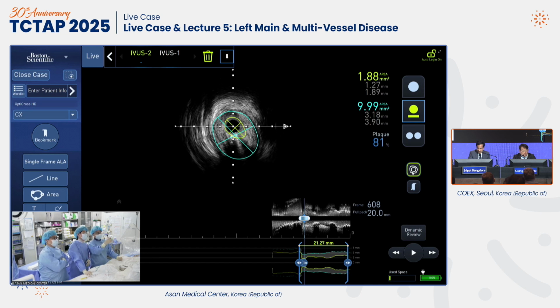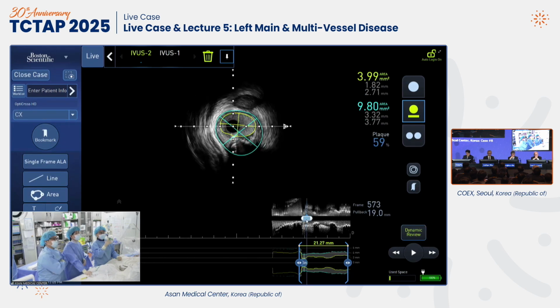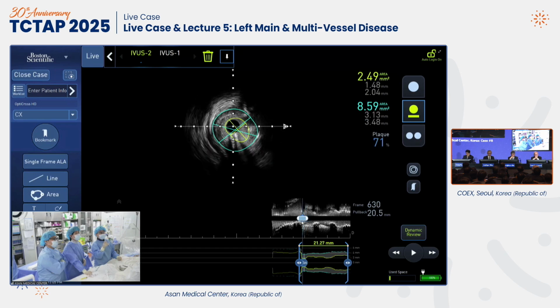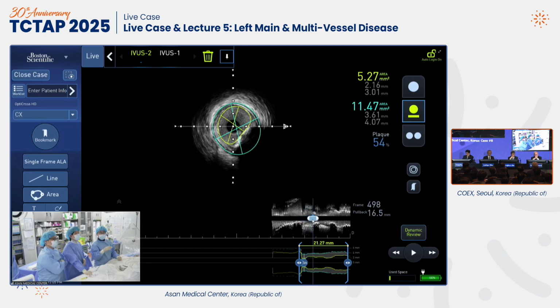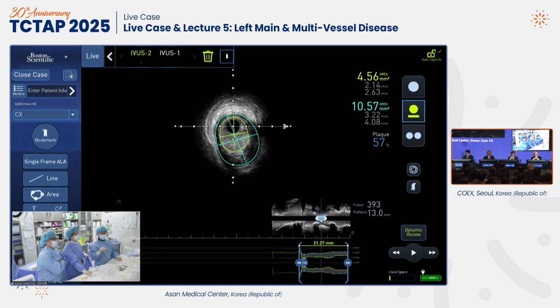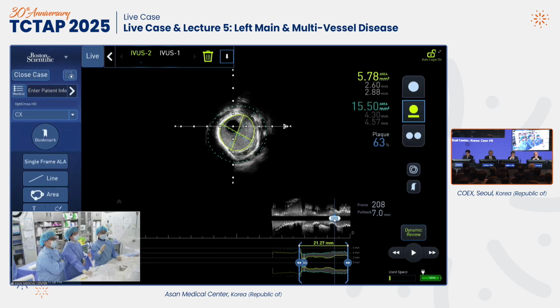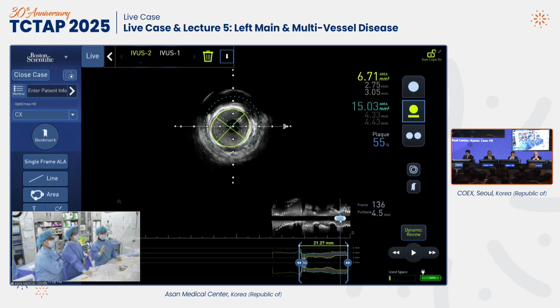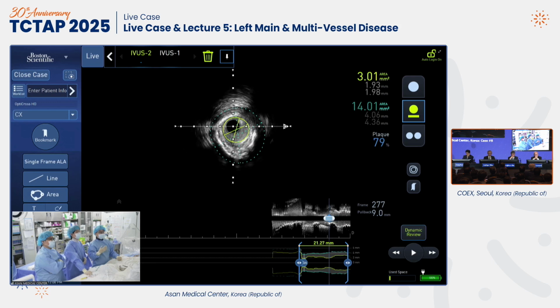This is the most narrow part. It automatically measures the tightest lesion and the vessel size as well as the lesion length. We have used the AVIGO system in several patients. Overall it is good, but sometimes severely calcified regions and some ugly lesions do not match. Overall, I personally feel the accuracy is good.